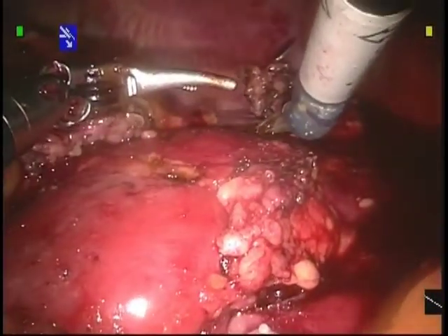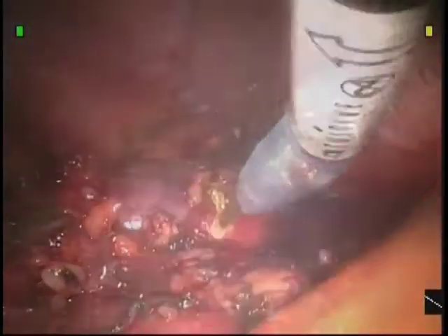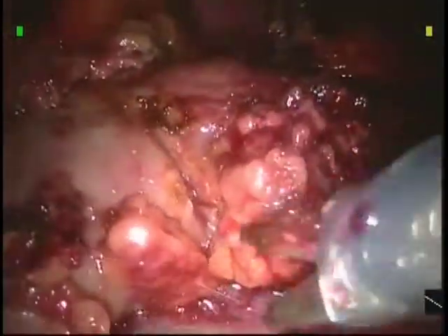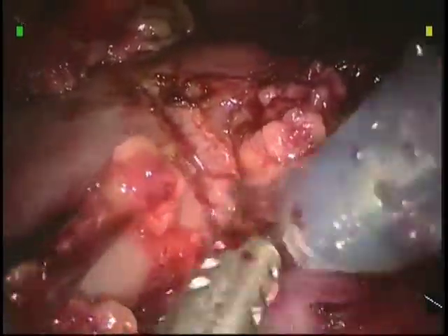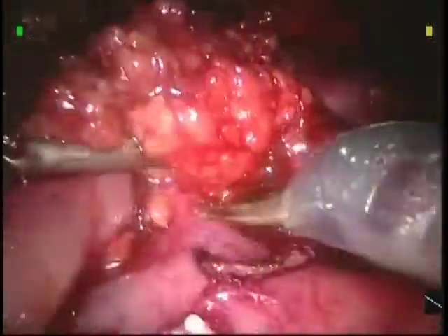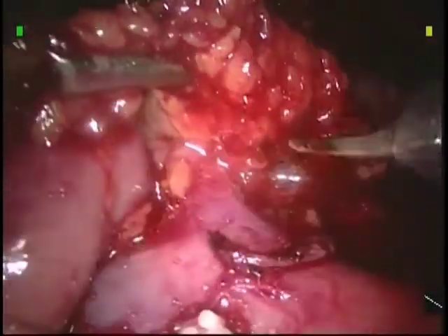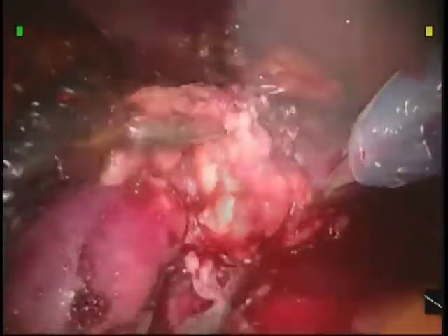Ultrasound is used to delineate the extent of the lesion. The capsule is scored to aid in the excision. As the excision proceeds, a branch of the renal vein going into the tumor is dissected free. It is then clipped and divided.